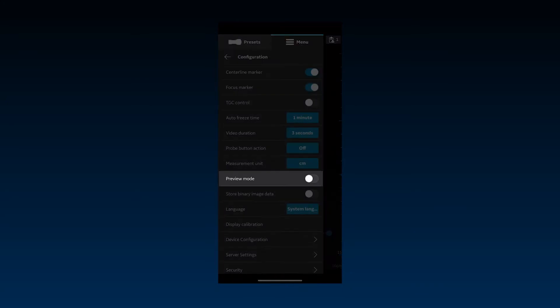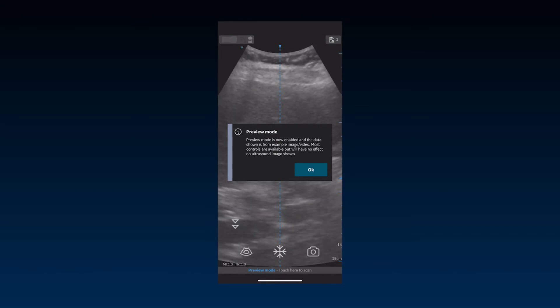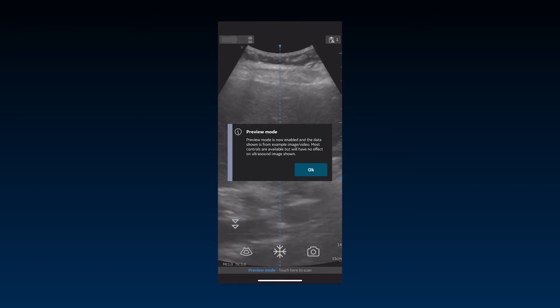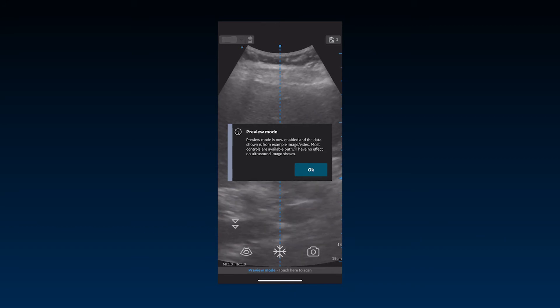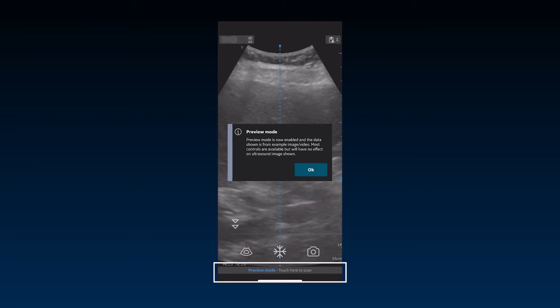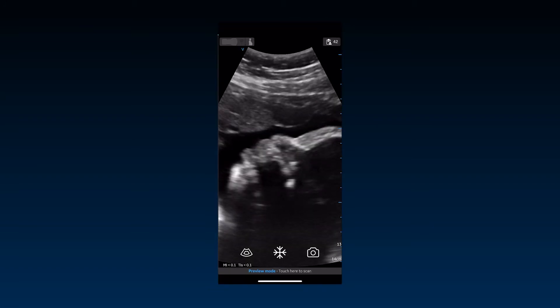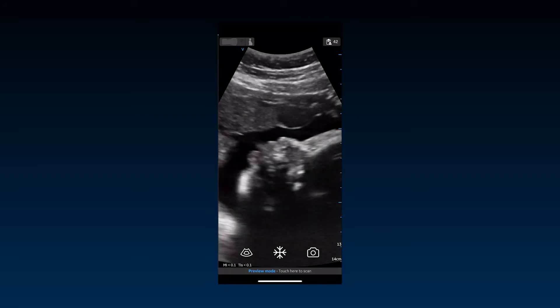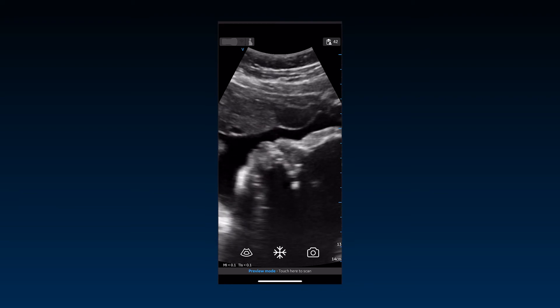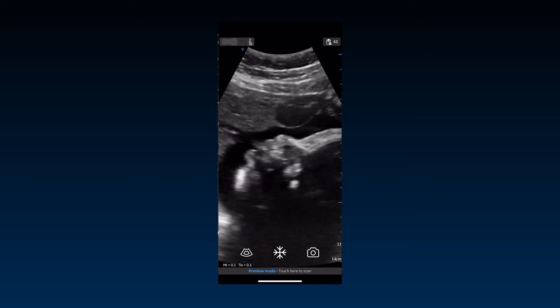Preview mode can be activated to explore the app functionality without a connected probe and can be used before registering your device. Scanning is disabled with only selected functions available in this mode. You can go back to scanning mode from the imaging screen at any time if you have a connected probe, enabling access to previously stored patient data.